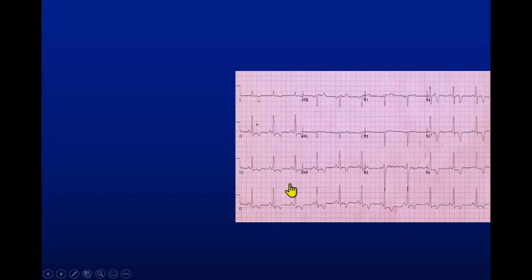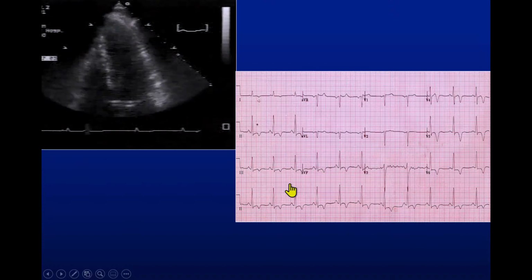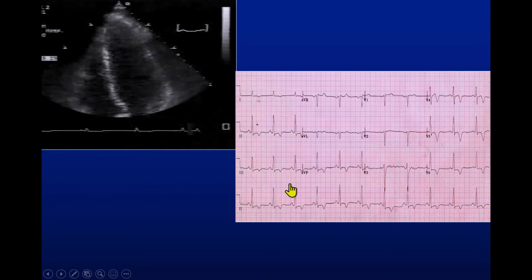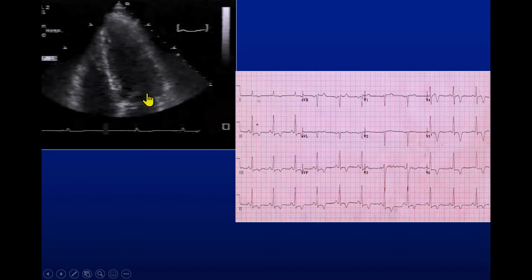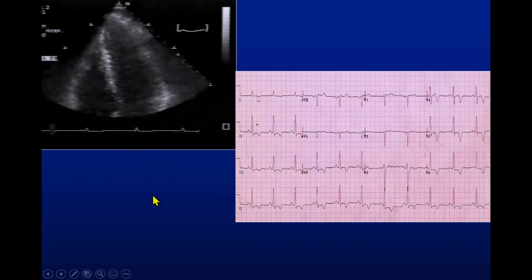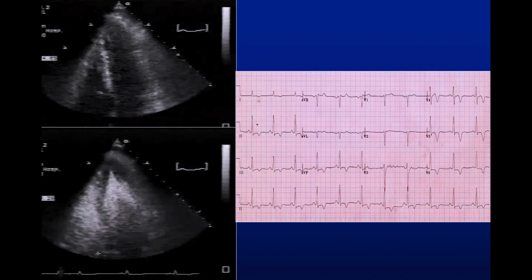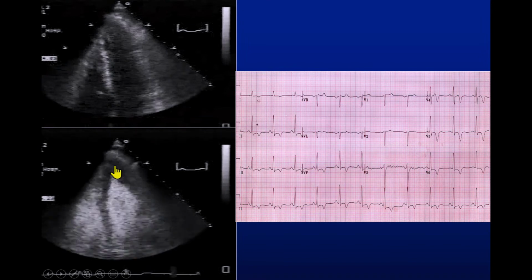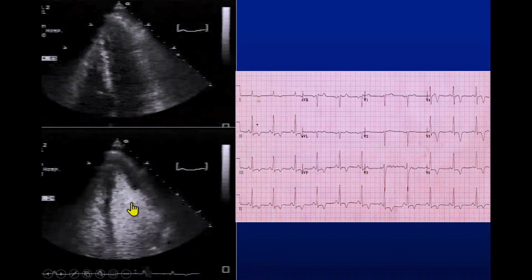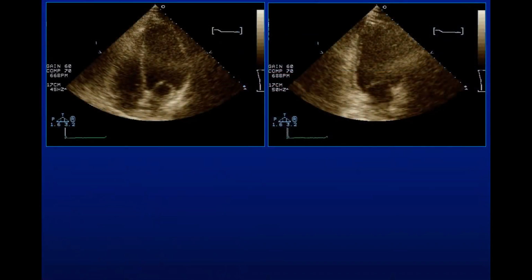Take a look at this EKG on somebody coming with chest pain. Could be ischemic, it could be an apical hypertrophy. You really can't tell from this, but certainly very abnormal. And on your echocardiogram, somebody coming with chest pain, you wonder about the apex here, whether this is abnormal, yes or no. Most likely leading towards abnormality, but that's all what you could see. And if you could use contrast, this is apical hypertrophic cardiomyopathy with some sequestration of a very tiny cavity, so the wall motion of the apex is still abnormal, but you could see the diagnosis is very different than what you had expected without the use of contrast.